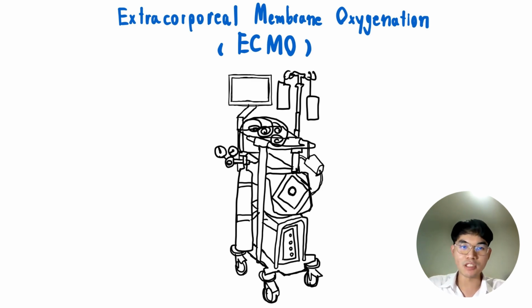Imagine an advanced machine that can temporarily take over the function of heart and lung, giving a patient's body time to change and recover from severe illness. This is not science fiction. It's a real medical device called ECMO.